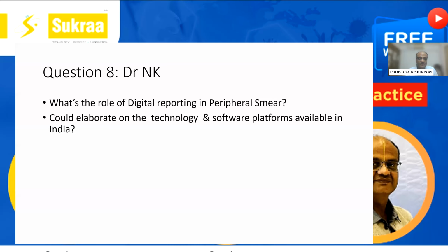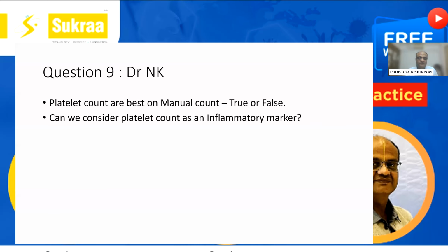That's great. So we'll go to the next question. We'll go to platelet count now. Most of the time we ask for a platelet count and the lab gives a platelet count. Suddenly, one call per day, I can rely upon this 100% because one of the counts would have been only 13,000 and the clinician calls asking please do a manual count. Do you accept this, or how will you tackle this?